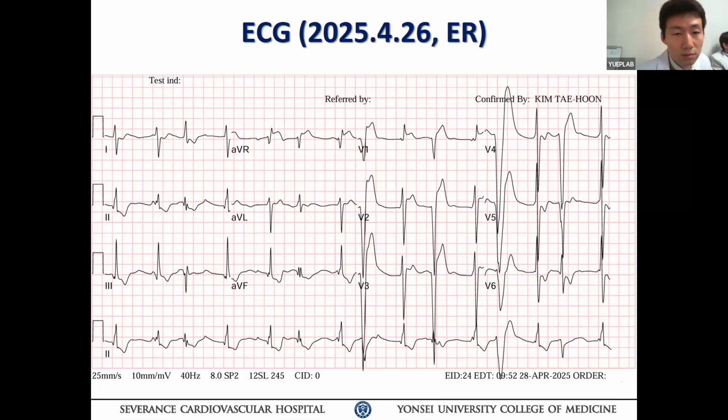And if you look at V1, there's an alternating LBBB and RBBB pattern. So all those are coming from the conduction system. That's why the QRS is narrow and there's some regularity. And it could be delayed after depolarization, triggered activity.